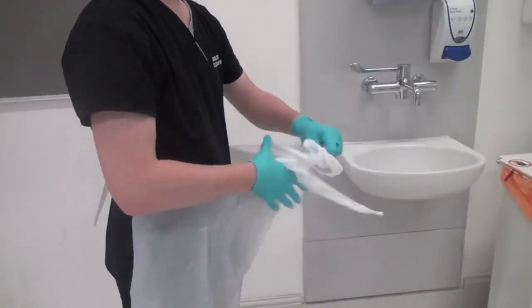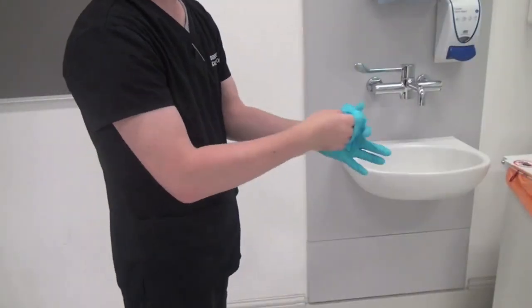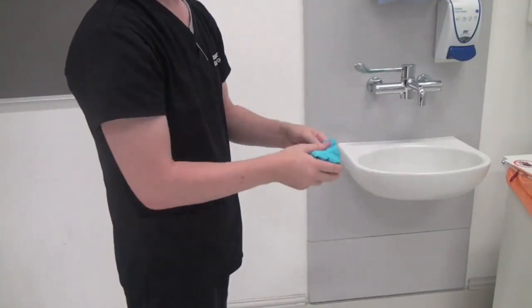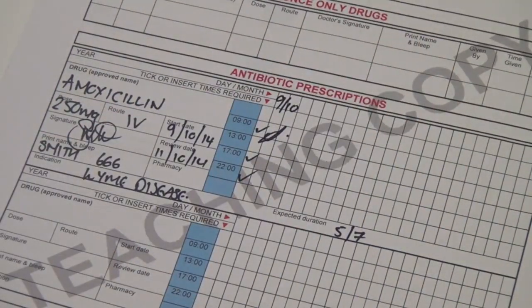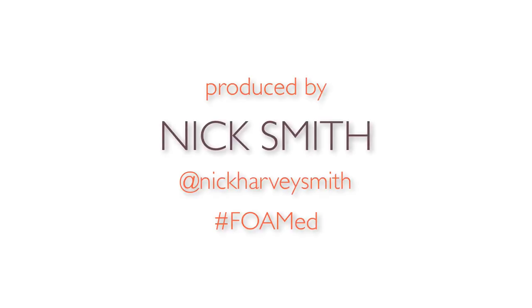Dispose of all your waste appropriately. Then make sure you've signed for the drug that you've just administered. So that's it — the basics of bolusing an IV antibiotic in under five minutes. Thank you very much for watching.